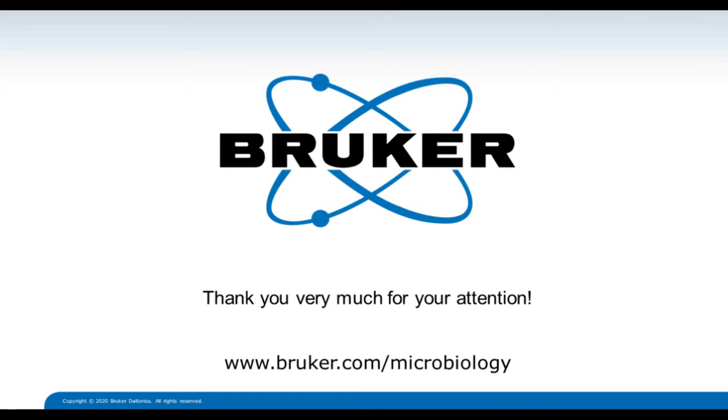Actually, it's just a bioinformatics capability for the subtyping. So nothing is necessary from the sample preparation. It's just a method by bioinformatics, by another complementary method, to draw out more information of the same spectra that have been acquired for identification.